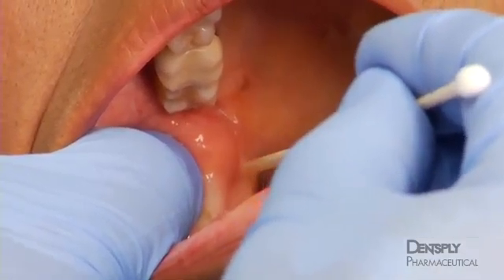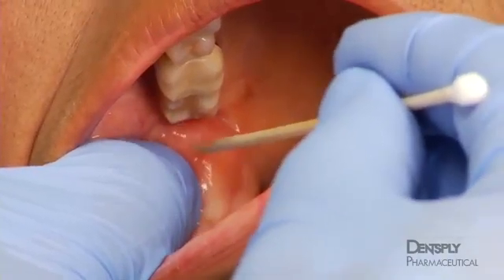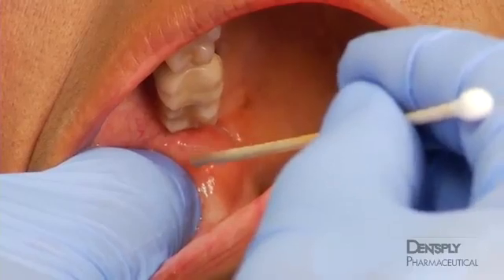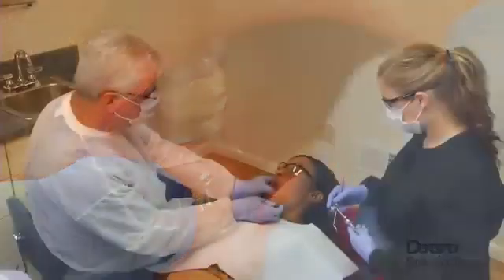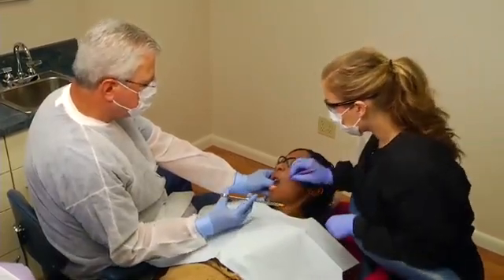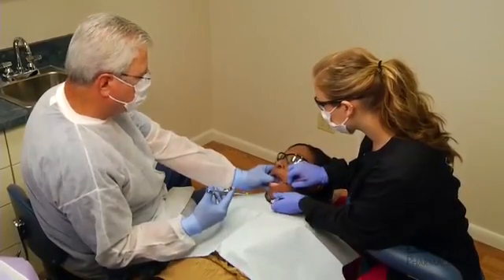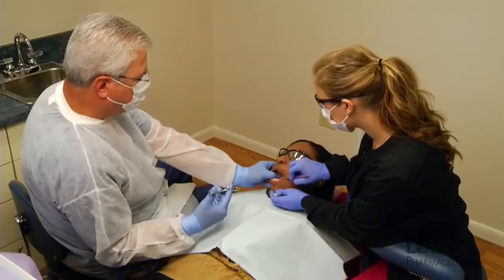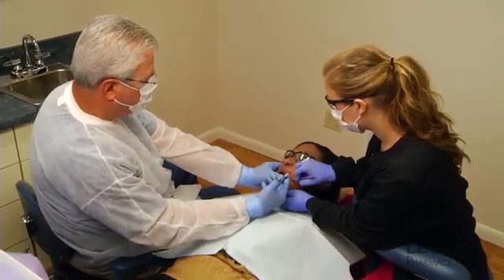The lateral border of the space can be determined by palpating the deep tendon of the temporalis muscle on the temporal crest of the ramus. The insertion must be made medial to this landmark. With the patient's mouth wide open, the thumb is placed over the anterior border of the ramus and pulled laterally, retracting the cheek and the buccal pad until it rests within the greatest depression of the coronoid notch and is made parallel to the mandibular occlusal plane.